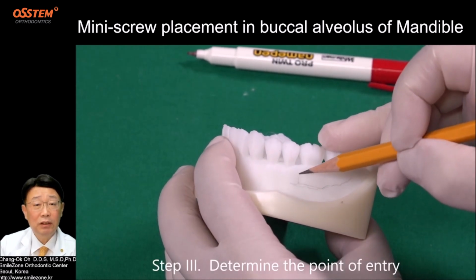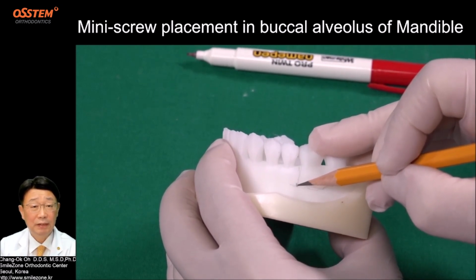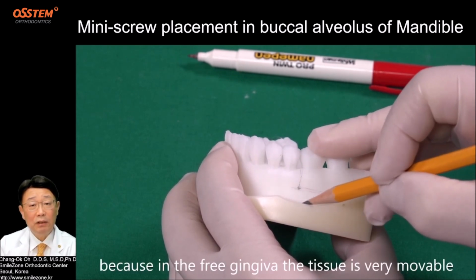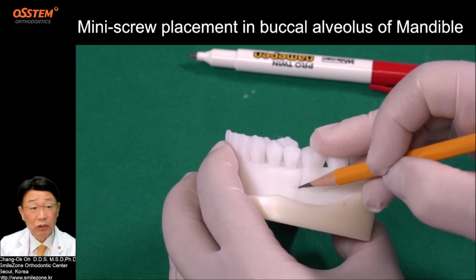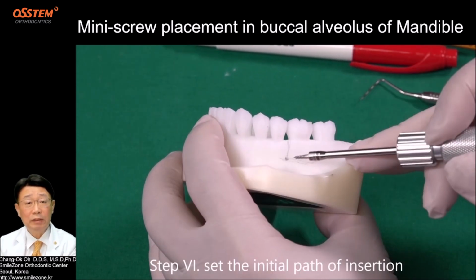Step 3. Determine the point of entry. Once the vertical line is marked, determine the point of entry. You cannot put it just anywhere on the line, because in the free gingiva the tissue is very movable. It is not good for stability of the screw. Choose an attached gingiva, apically as much as possible for wider space.